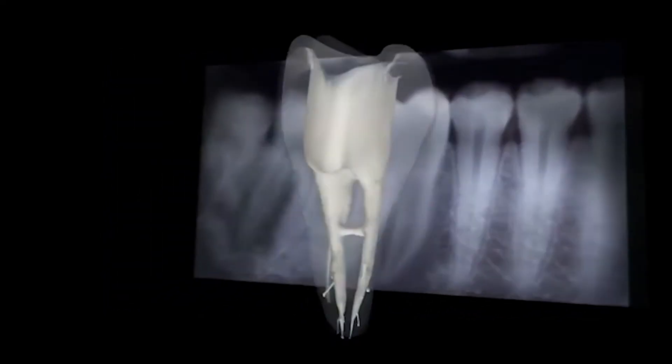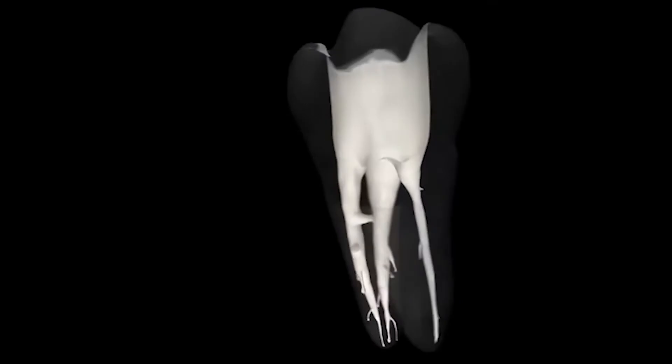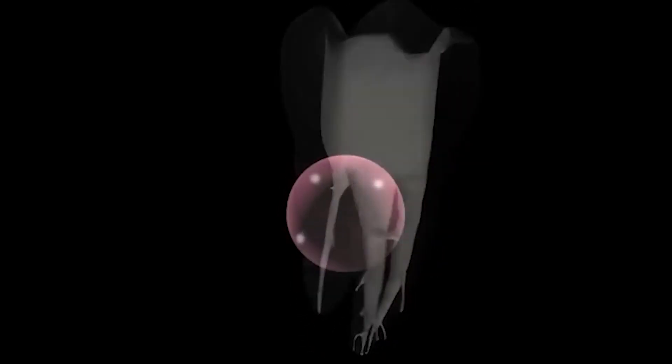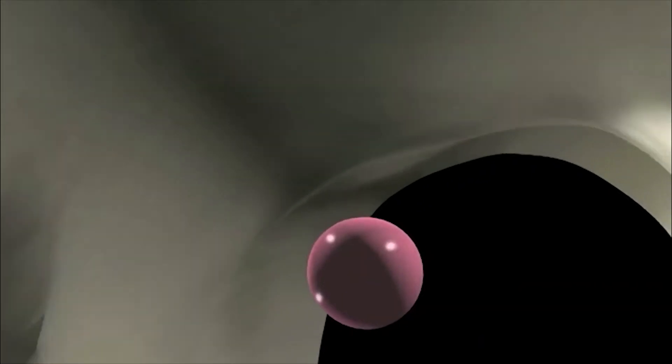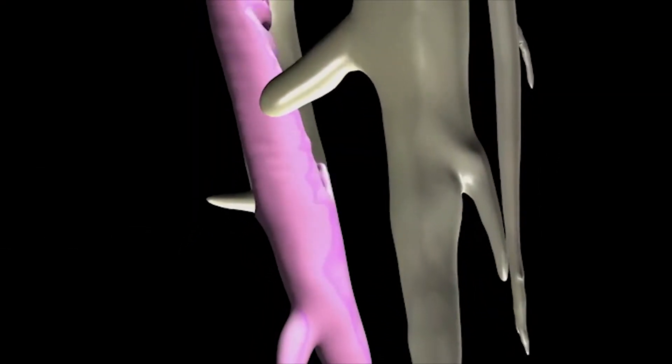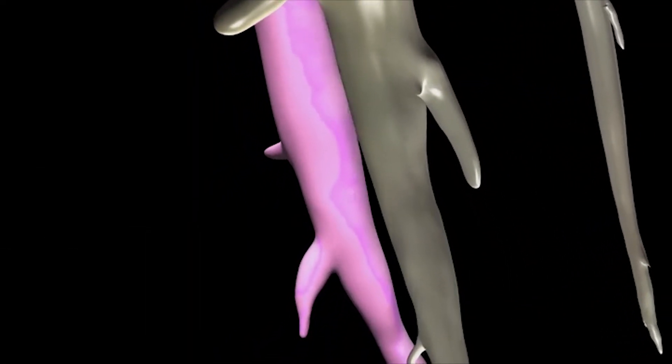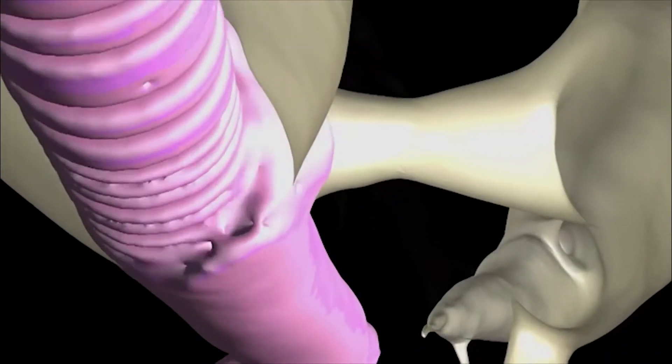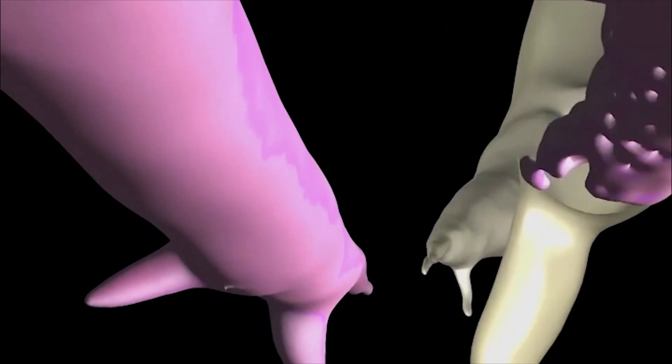Place Guttapercha Core into the root canal system in one smooth motion without excessive force. The cross-linked Guttapercha Core centrally compacts the alpha-phase Guttapercha with a hydraulic force that sends it flowing in three dimensions into laterals, isthmuses, and accessory canals.